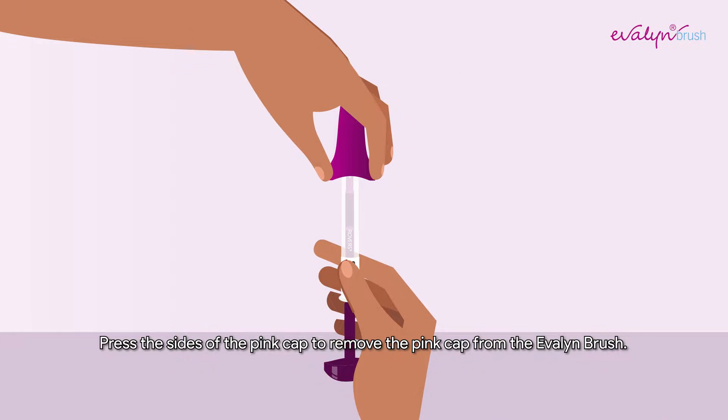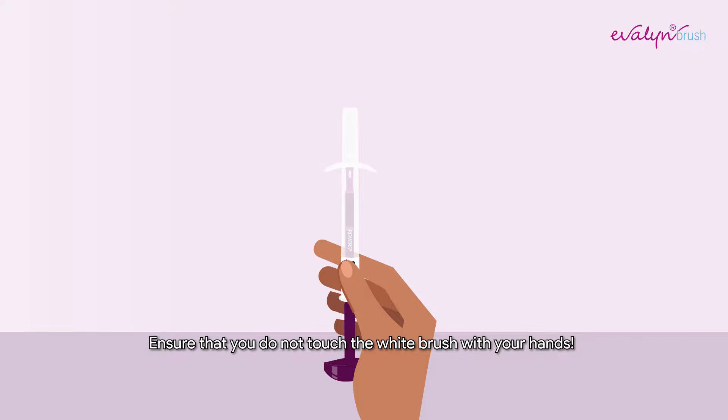Press the sides of the pink cap to remove the pink cap from the Evelyn Brush. Ensure that you do not touch the white brush with your hands.